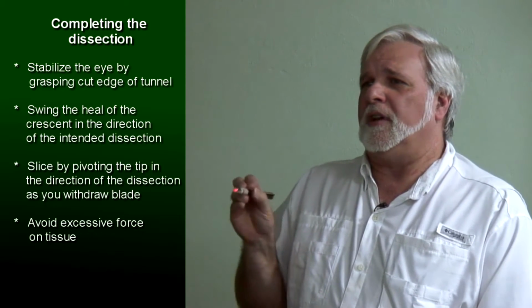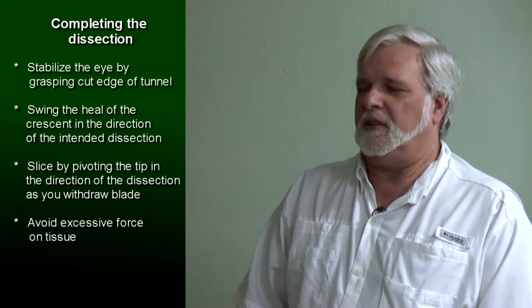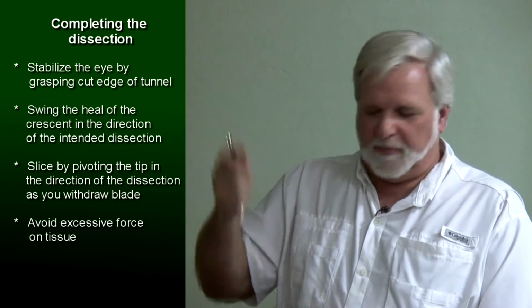Swing the heel of the crescent blade in the direction of the intended dissection. This is counterintuitive, but the idea here is that no one slices their steak by just laying the blade down on top and pushing as hard as they can, do they? No, it will not work very well. If you push your knife down on the top of the steak, you will not be eating any steak for a while. It's just not going to happen. So what do you need to do? It's the movement of the knife against the steak that makes the cutting happen, correct? Well, it's exactly the same with this.